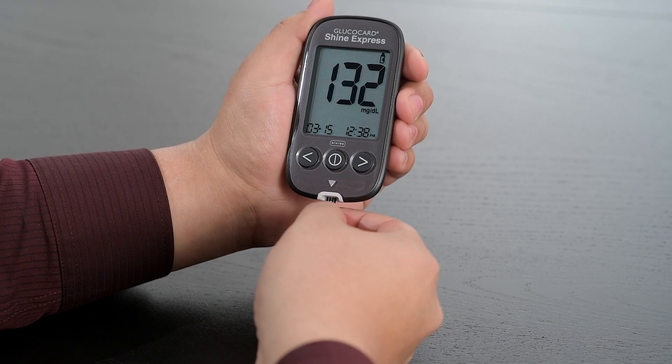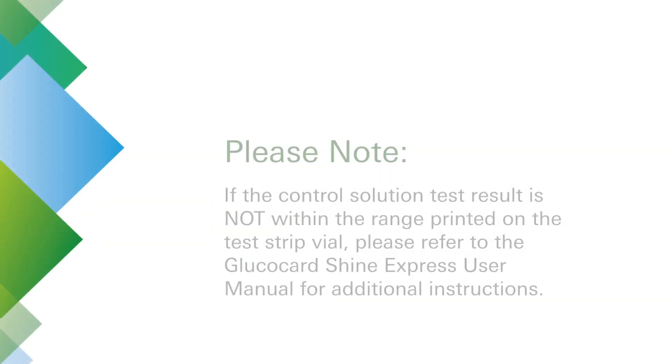Remove and dispose of the test strip. If the control solution test result is not within the range printed on the test strip vial, please refer to the Glucocard Shine Express user manual for additional instructions.